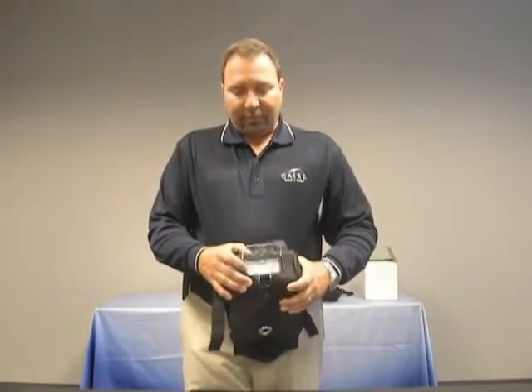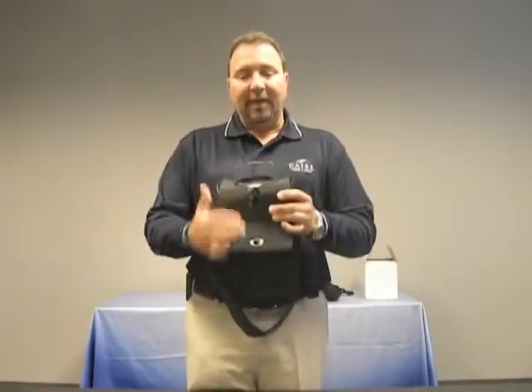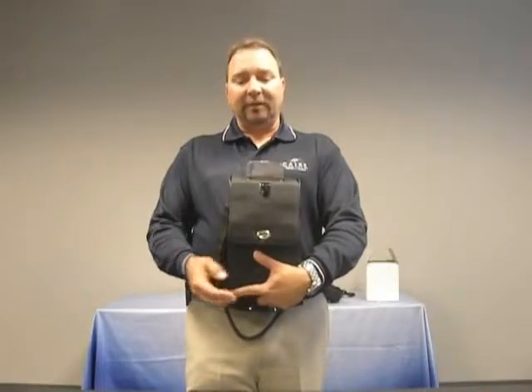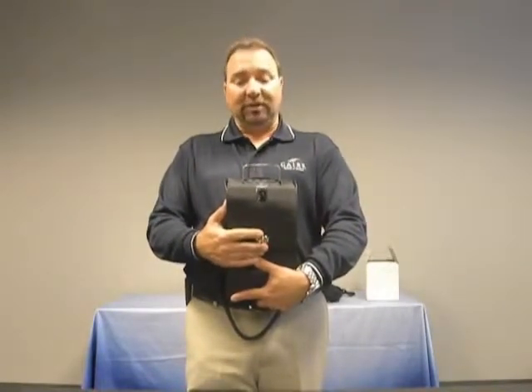Once the alarm is heard, you can let go of buttons 1 and 5, and the FreeStyle 5 will automatically go into a pulse mode setting. This allows you to perform an oxygen concentrator test by placing an oxygen analyzer directly to the outlet port to determine that the oxygen output is within test specification.